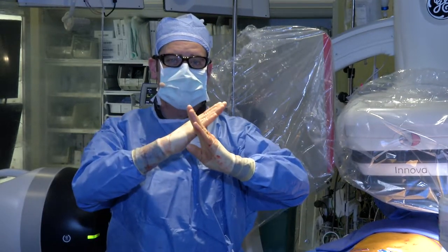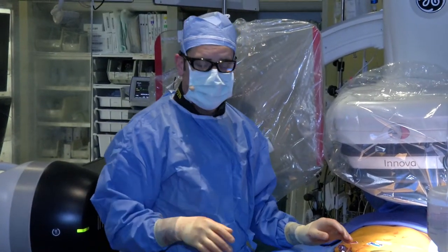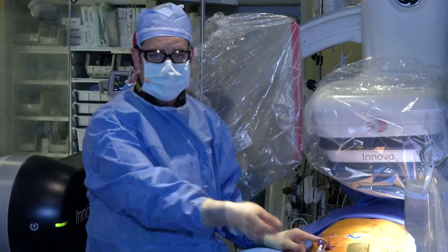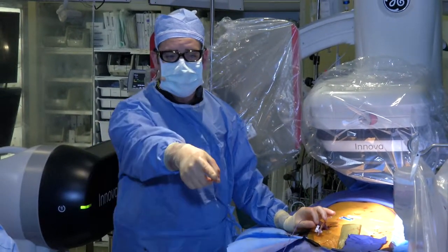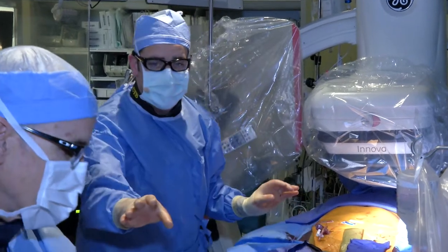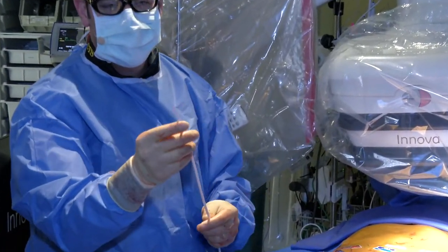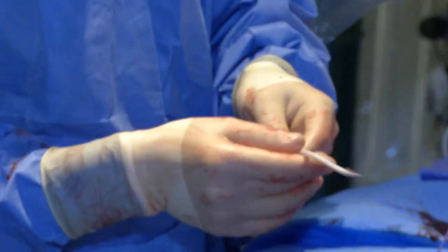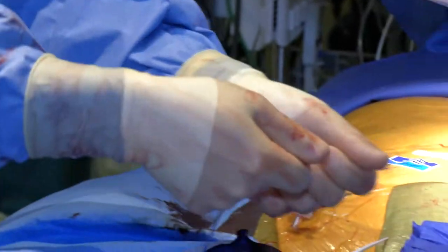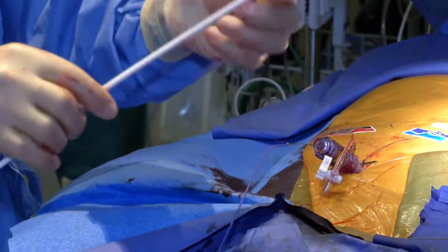But the crisscross does help, and at the end of the case, when they're done deploying the valve and we take the sheath out, instead of just pulling the sheath out, we put the dilator back in. And the reason for that, can I have the dilator real quick, Matt? I just want to show them this. The reason we put the dilator in is for two reasons. Number one, this starts small and goes larger. What we do is by putting this back in the sheath, when we're removing the sheath, we're actually kind of cinching down on the suture slowly, and this is like a reverse dilator.